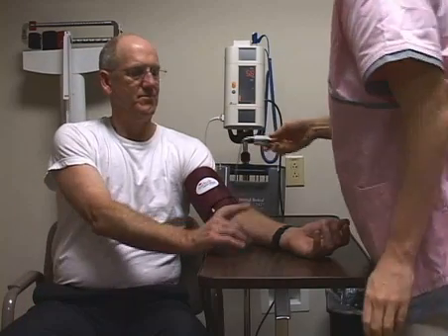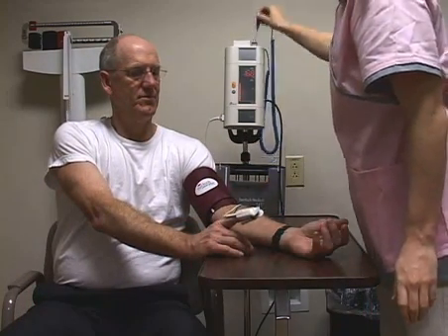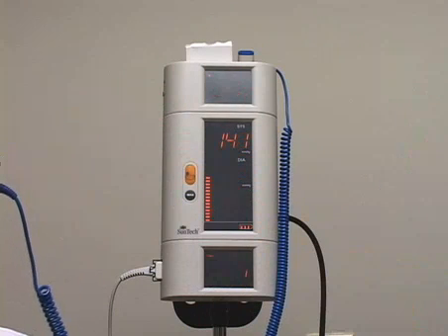Next, place the SpO2 sensor on the hand opposite the blood pressure cuff to ensure accuracy. With the other two started, remove the temperature probe, put on a probe cover, and place it in the patient's sublingual pocket.